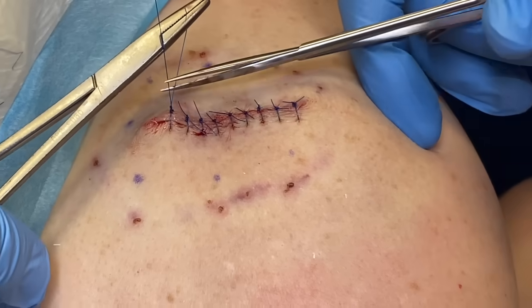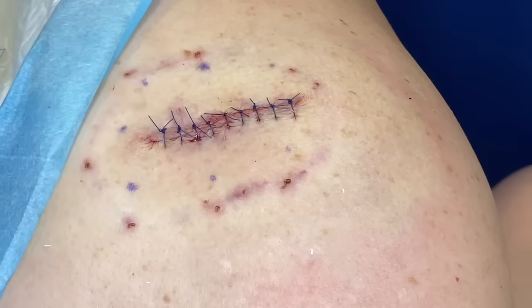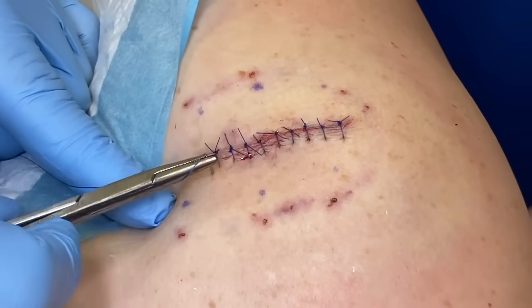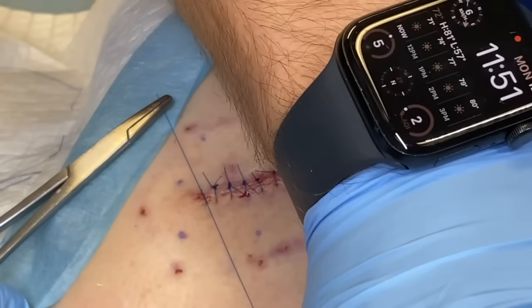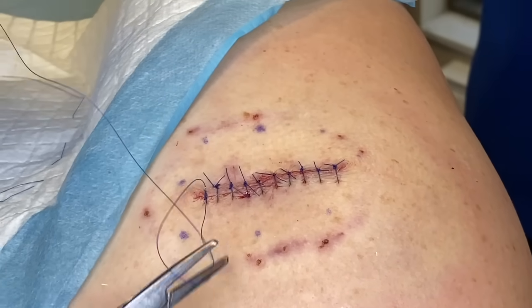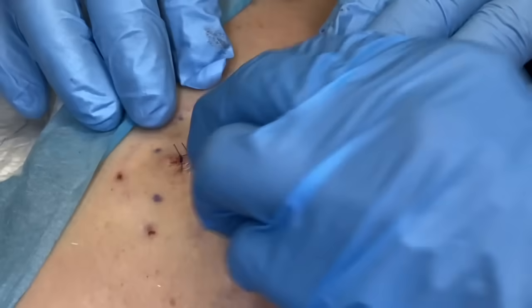And what's good is you just want them to close together. If you're knotting really hard, you'll buckle the skin, and that just makes the healing result a little bit less ideal. Good. Almost good. Very good. So there's our incision line.